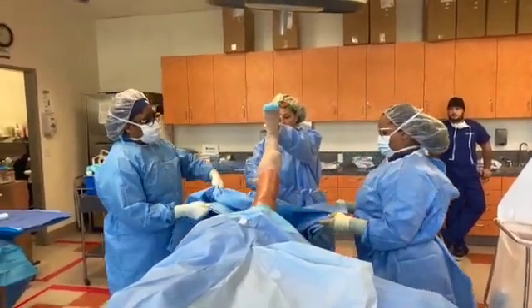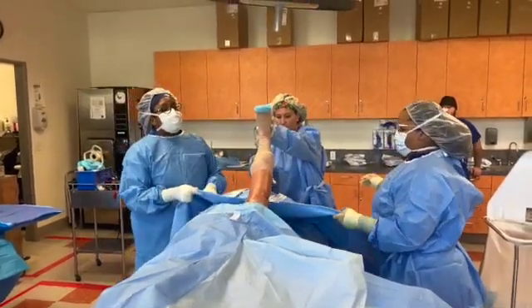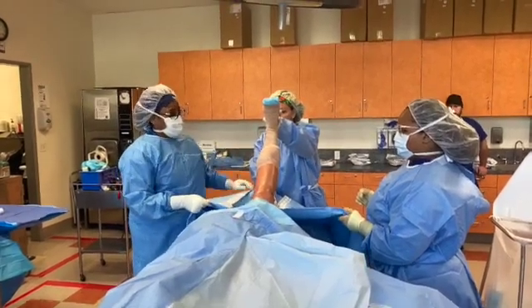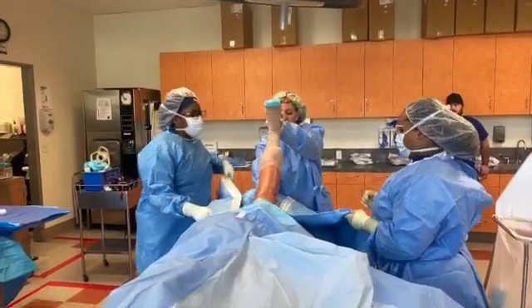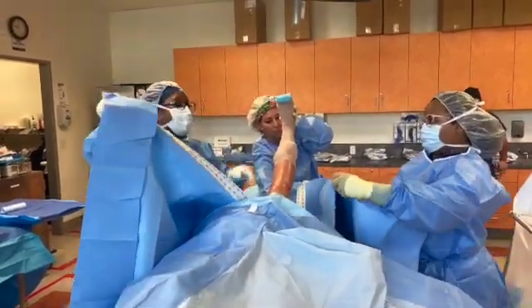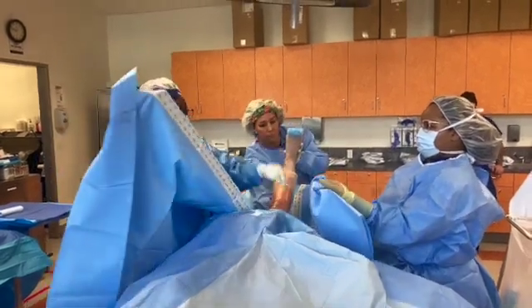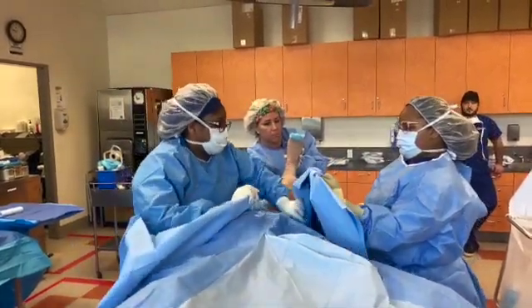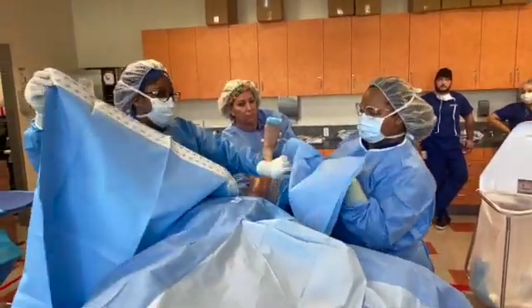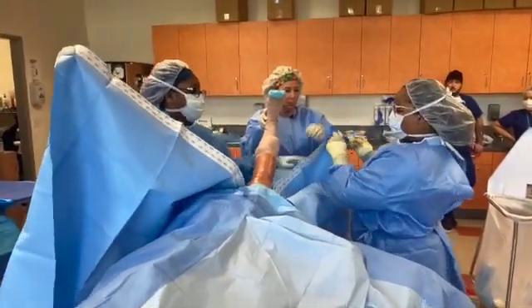Watch, everything's cut. As you notice, she's helping. With this particular drape, we're not going to take the stickies off because we only have 3 of these. Stickies come off. And I always ask the doctor, would you like to kiss or cross? Kiss, meaning these 2 stickies are going to, so Bree, when you're grabbing it, you got to see how the doctor's doing it. You should be holding this part right here, okay?